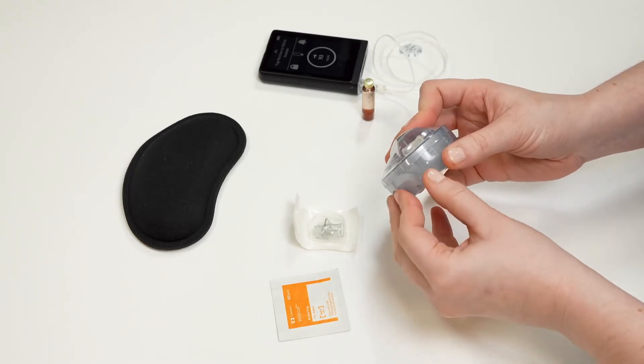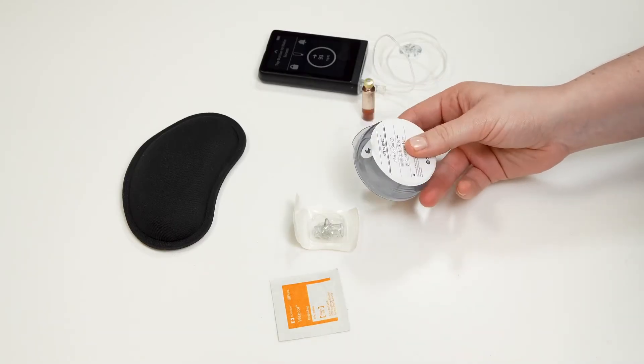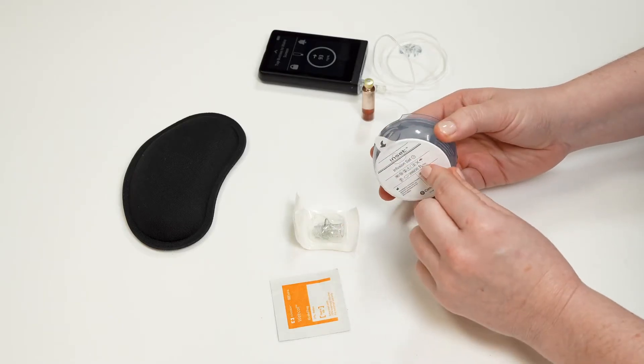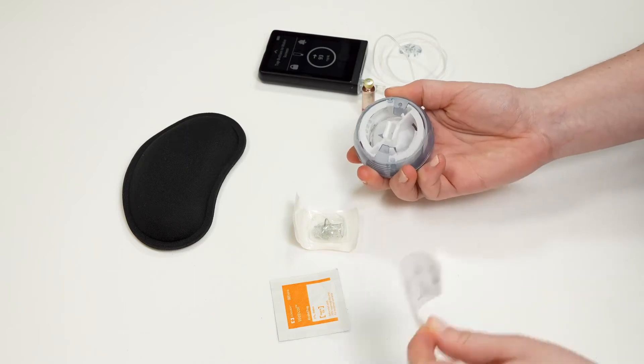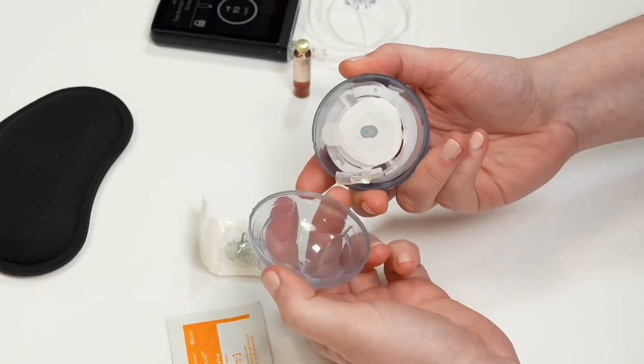Open your inset infusion set by pulling on the red tab and removing the plastic wrapping. Next, use the pull tab to remove the white paper from the bottom. Then use the handle to pop open the top of the infusion set.